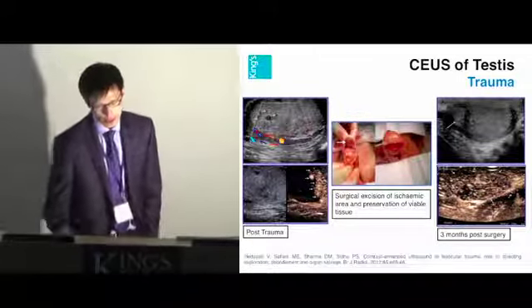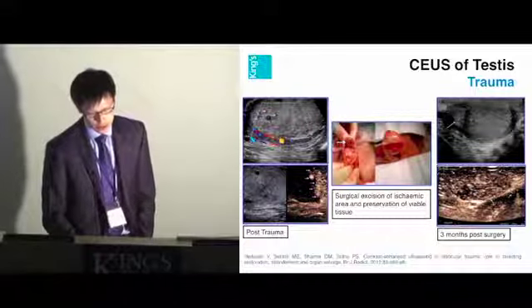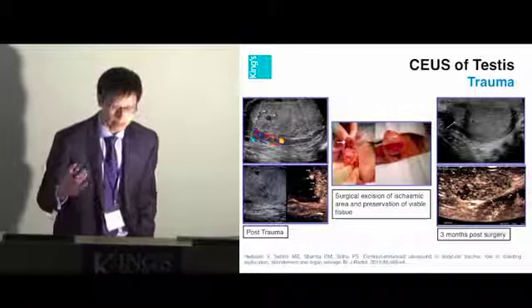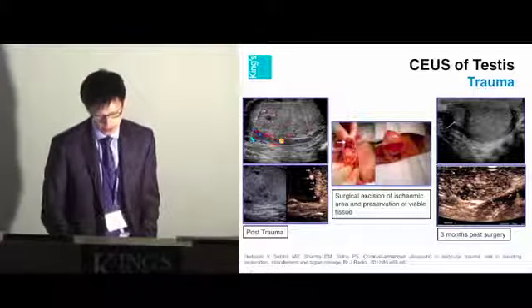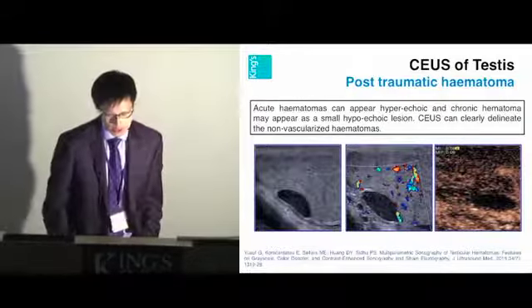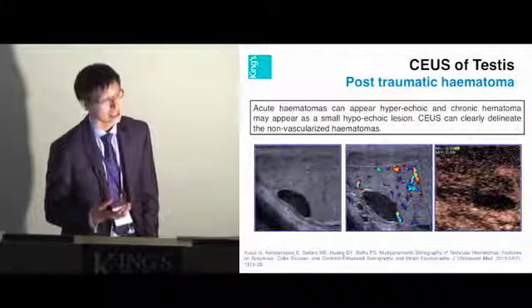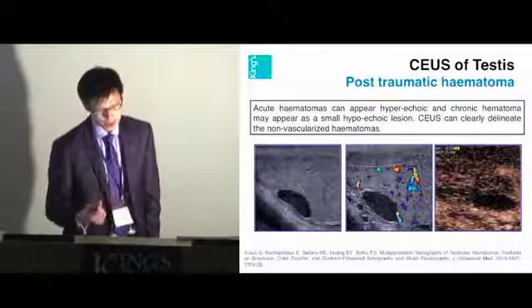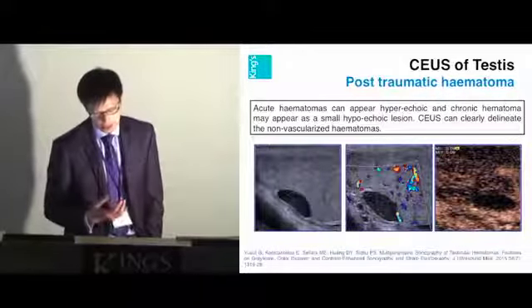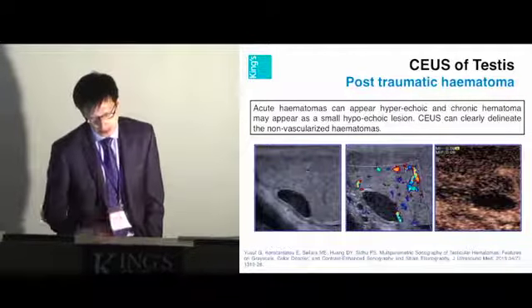The ischemic area was excised and the remaining testis was preserved according to the preoperative contrast ultrasound image, which clearly demonstrated viable tissue to be saved during the operation. Three months later, reperfusion of the entire remaining testis was confirmed. This highlights CEUS in offering an imaging pathway to assess viability and vascularity. In chronic post-traumatic hematomas, when we encounter any hypoechoic lesion within the testis even with a trauma history, CEUS can identify the absence of vascularity, which is a hallmark of a benign lesion.